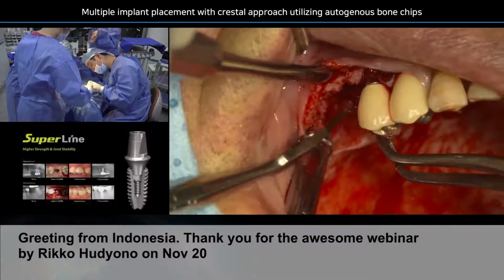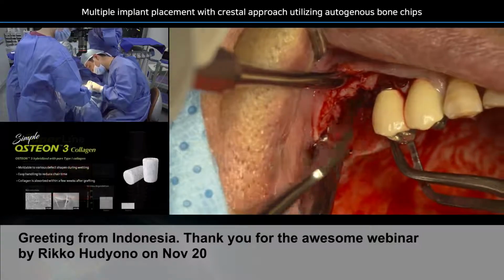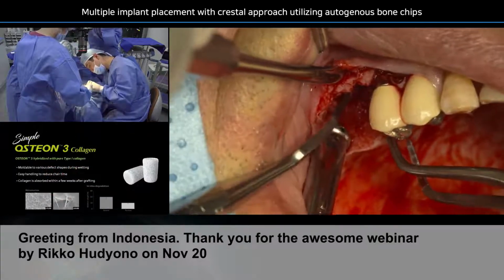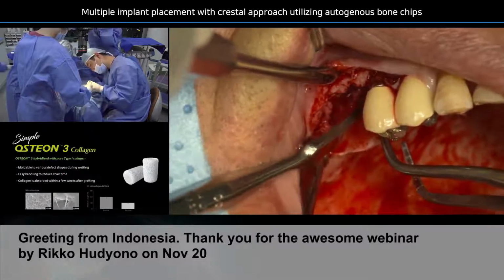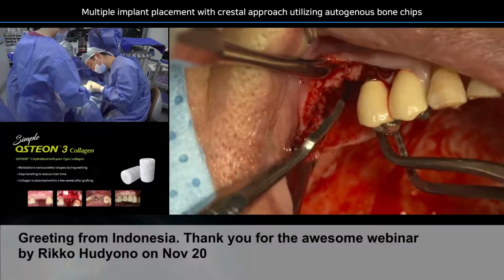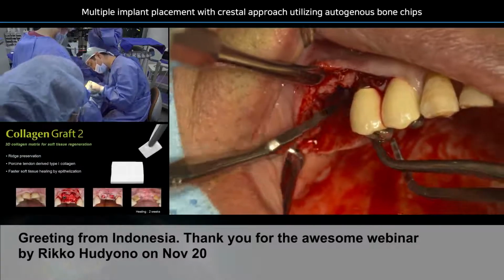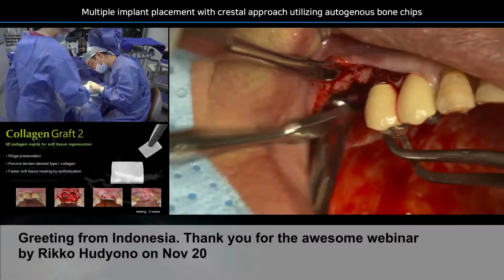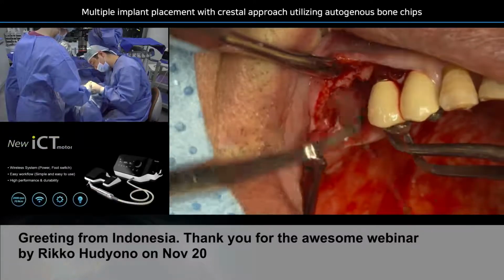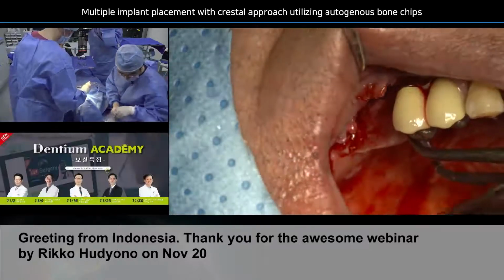The bone does not really like the soft tissues, because if they get between the implant surface and the bone, they cannot really become bone. Later, many years later, maybe they will become bone, but in the early stage of osseointegration, it requires fresh bone cells, not the soft tissue. So I'm removing all of the soft tissues here.